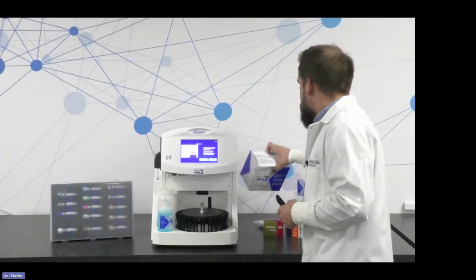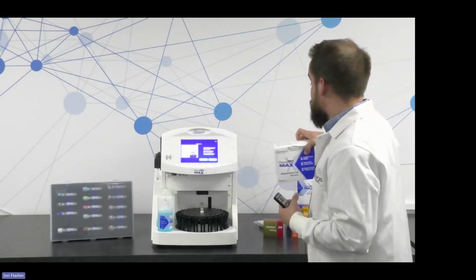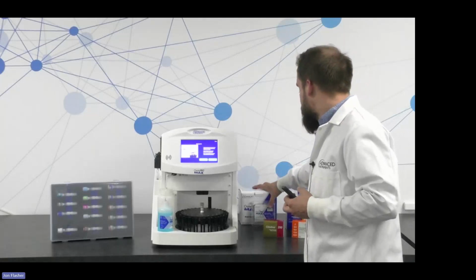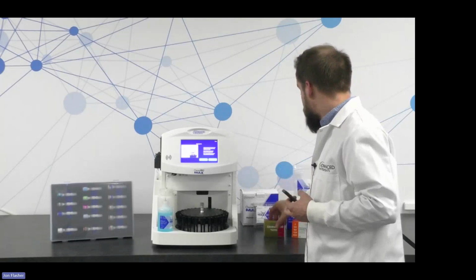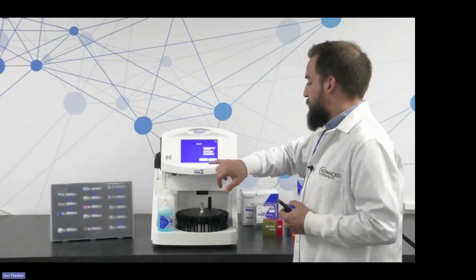So just like we did on the calibrator kit, this Max 500 kit has the same symbol. It'll take you through step-by-step instructions on changing your system fluid, changing your peristaltic tubing, emptying your waste container, as well as performing that enzymatic cleaning step. So really intuitive user experience.